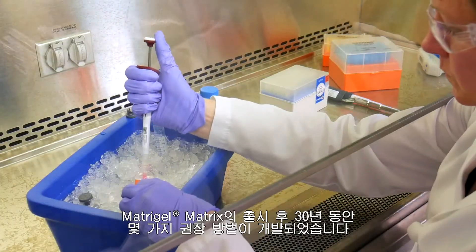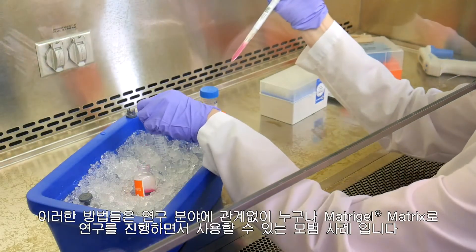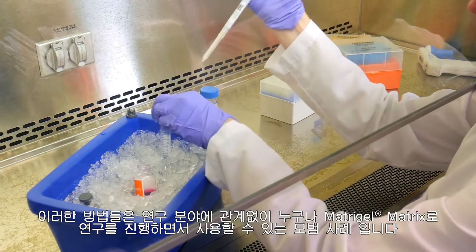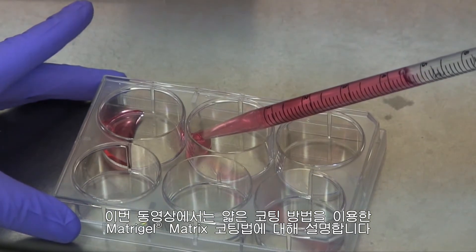In the 30 years since the launch of Matrigel Matrix, some recommended methods have developed. These are best practices that anyone can use while working with Matrigel Matrix regardless of application. This video covers how to coat with Matrigel Matrix using the thin coating method.